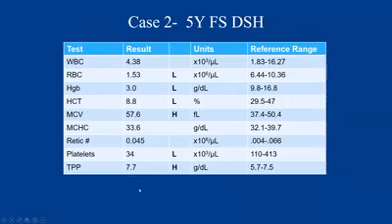And then we also have a pretty marked thrombocytopenia, so low platelets, and an elevation in total plasma protein. Now, obviously, the first thing we want to do is make sure that there's no platelet clumping. Cats love to clump their platelets. And I can tell you that we did, obviously, do a blood film review and there were no platelet clumps. So this was a real finding for this patient, okay? So we have a bicytopenia, so 2 cell lines being low, which is concerning.